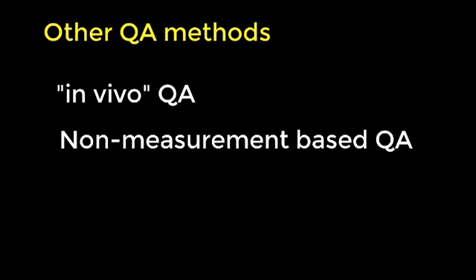So both of these approaches, they might be used in combination with the other approaches that we already talked about, doing a measurement before treatment. And I think it's somewhat more controversial to use them instead of that approach, but some people are also doing that. So let's talk about in vivo QA first.